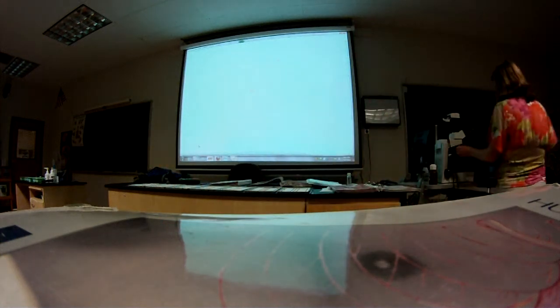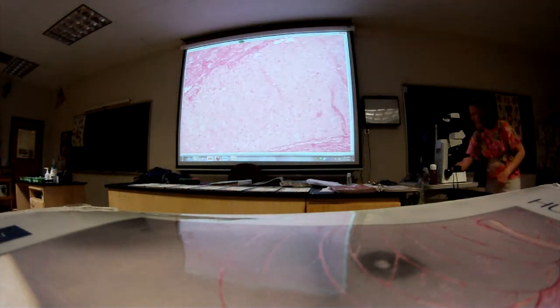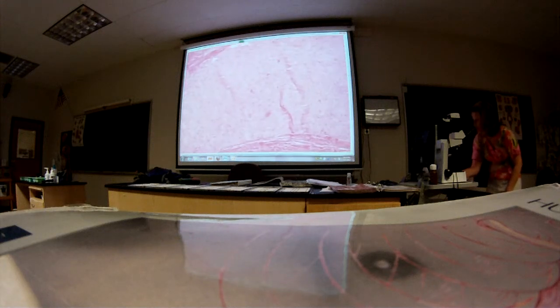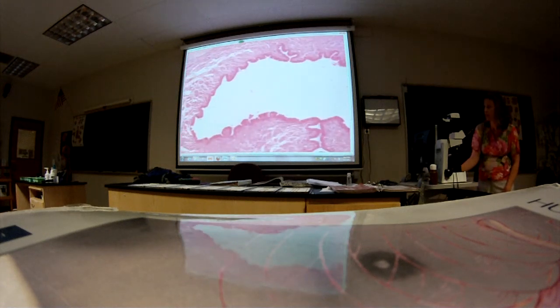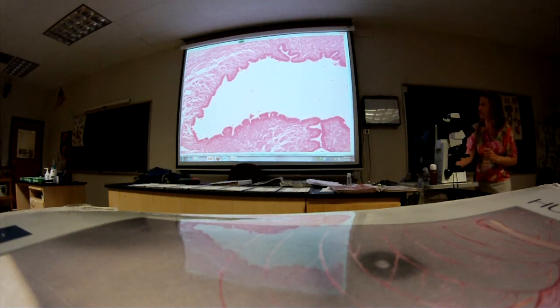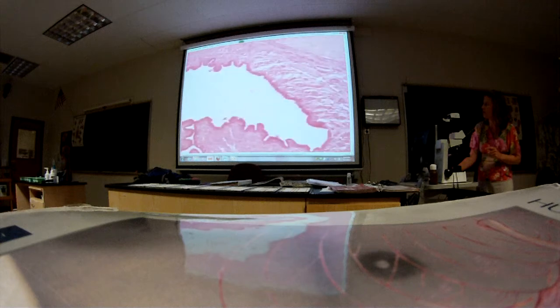G18. Sarah, yeah. Collagenous sheath, is that also on the exterior, like all around? Yes. Or just in between? It's all around, yeah. Okay, so this microscope, as you know, is higher power than even yours, so we can't get the full view, which is why I like to supplement with the picture when I'm testing you on this one, because we can't get the full view, just like when we did the spinal cord. It's too big.